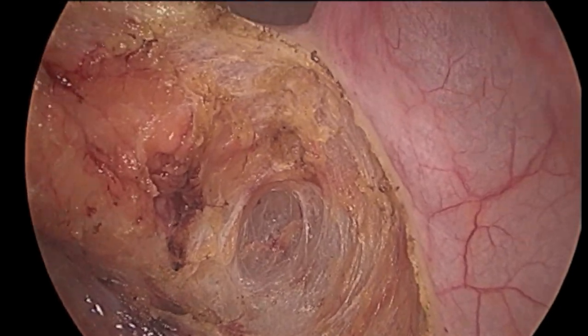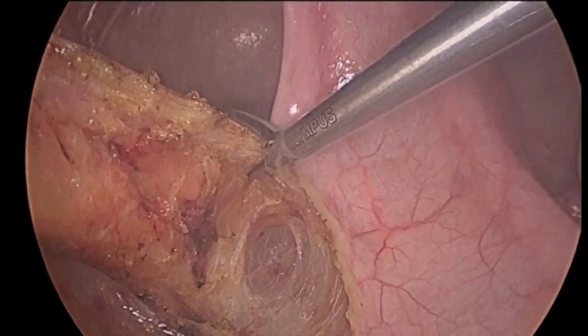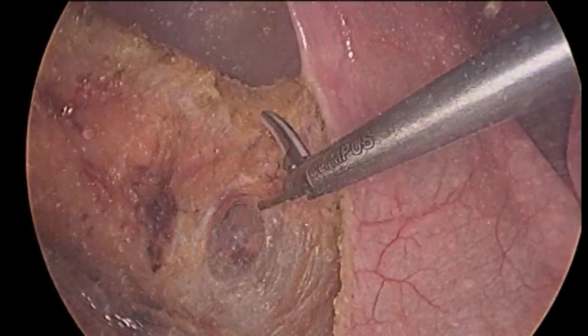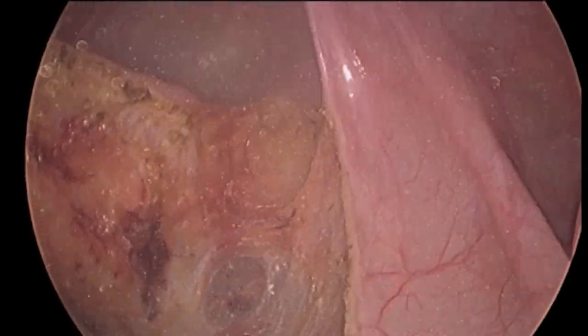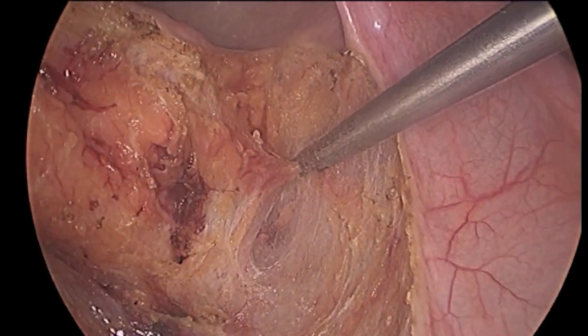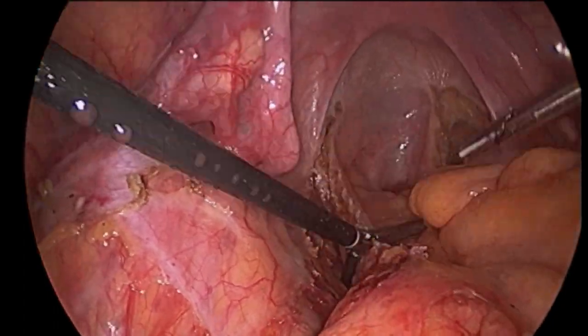As the pelvic floor is approached during dissection, the space around the rectum becomes more narrow. Careful attention is given to blood vessels and surrounding organs, such as the vagina in women and the prostate gland in men, so as to avoid injury. Much of the dissection is carried out using the ultrasonic scissors, which seals small blood vessels as they divide tissues.